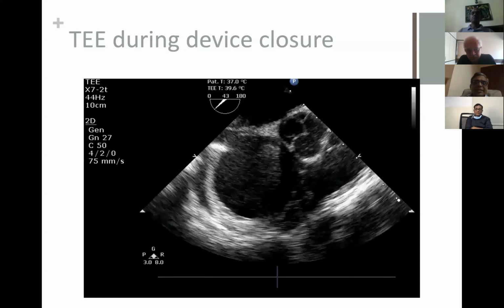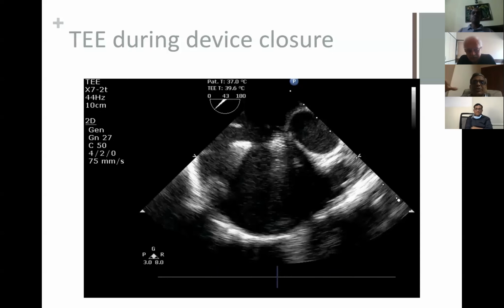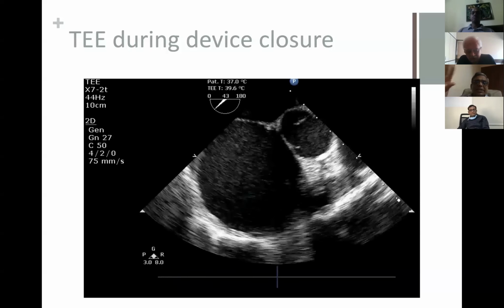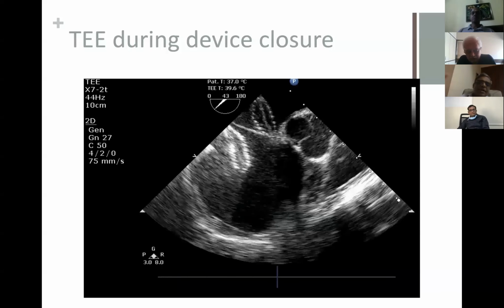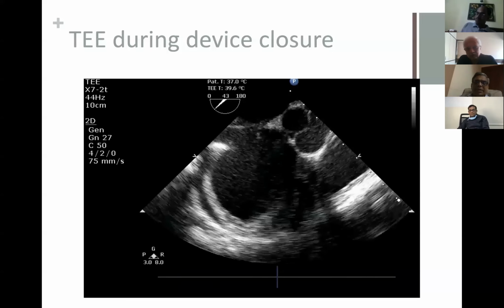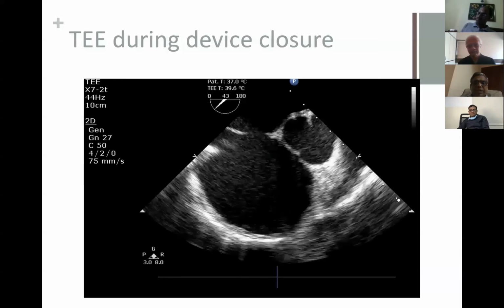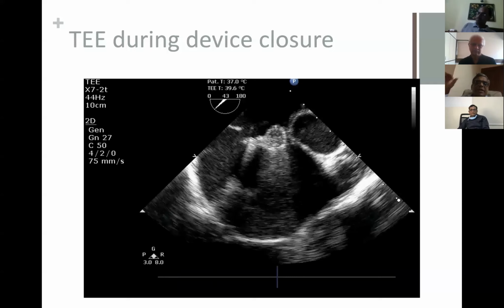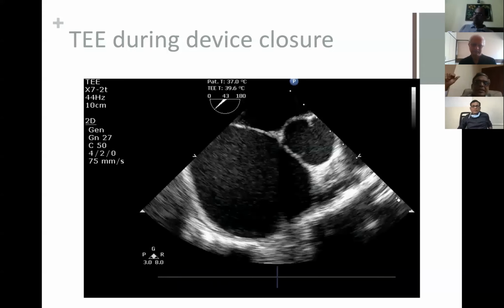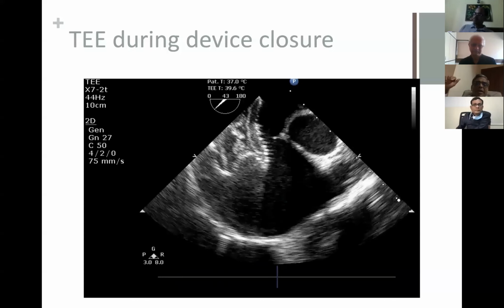Instead, making sure that your device will stay away from vital structures is a much better way. Avoiding the mitral valve rim in particular, making sure your device will not actually come in the way of the mitral valve. That may be a more appropriate way, not ridiculously oversizing in patients who are small. These are the methods of looking at it.